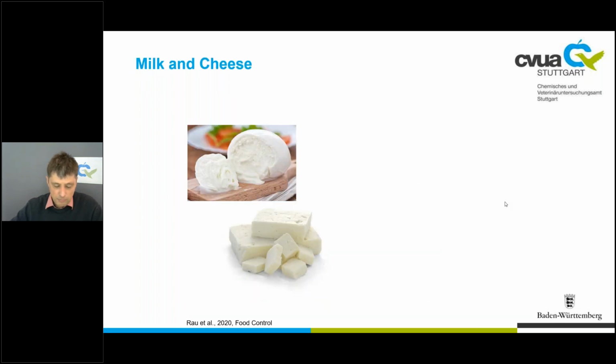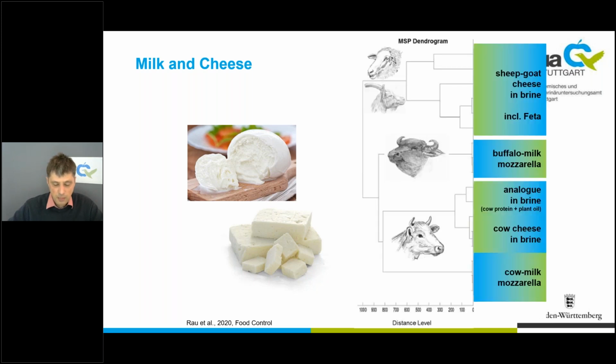A smaller, but also often used application was created for cheese. Mozzarella from buffalo or cow's milk, and feta from sheep or goat and cow, are connected frequently with food fraud problems in restaurant samples. MALDI helps us here to get a valid result for the main animal species in 50 minutes.